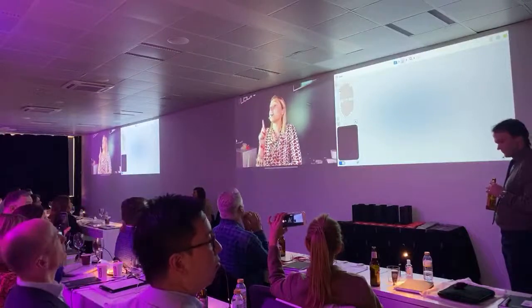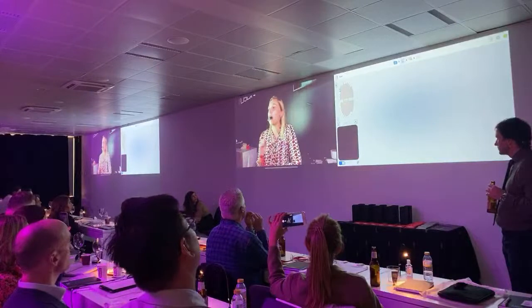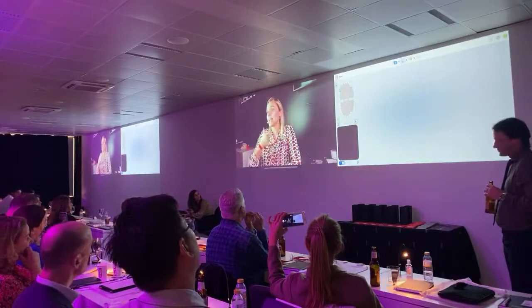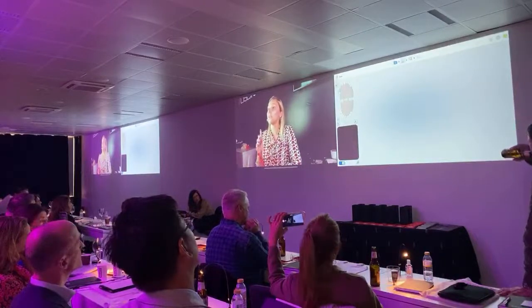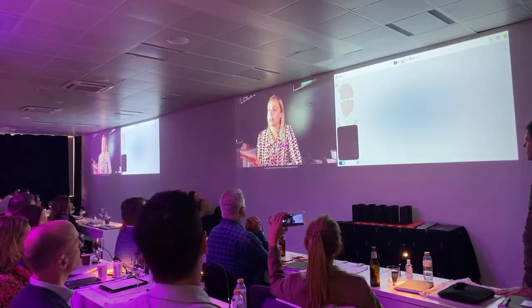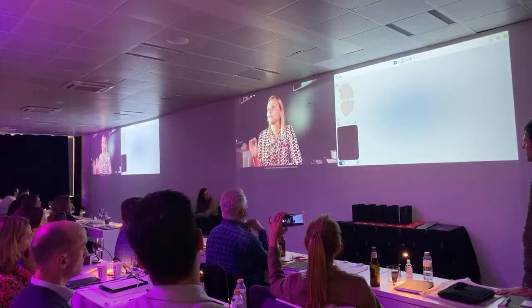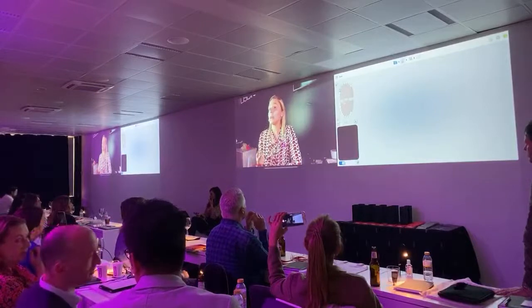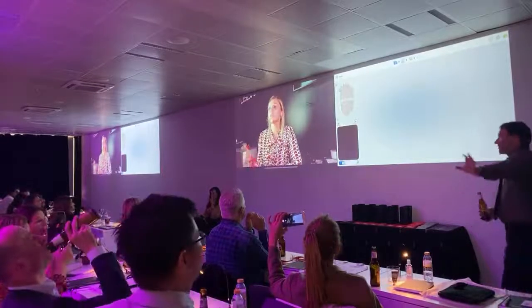Another thing that is very, very important, if you are going to prep a full arch, first, before when you place the post-treatment mock-up to do your prep over, before you prep, scan it as a pre-op scanning. And send this to Angelo too, especially if you're gonna prep everything as crowns, because this will help him to overlap images. Am I right, Angelo? Always do it. Amazing tip.